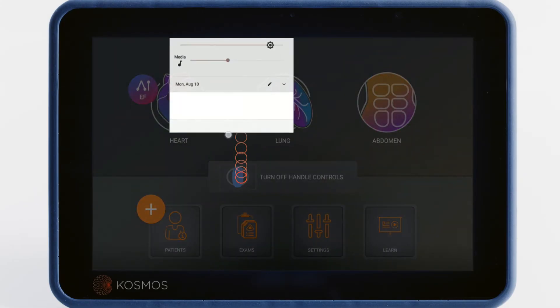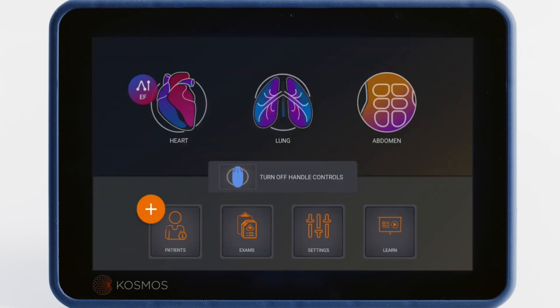Tapping the top margin of the screen and dragging your finger down will also open a menu to quickly adjust the bridge's volume and image display brightness.